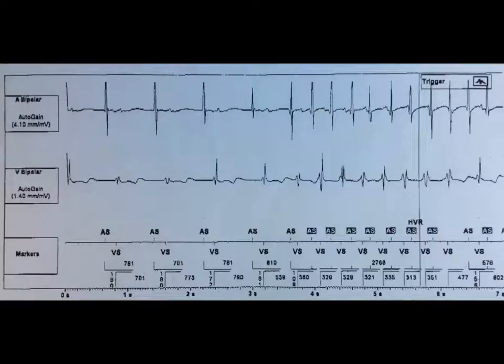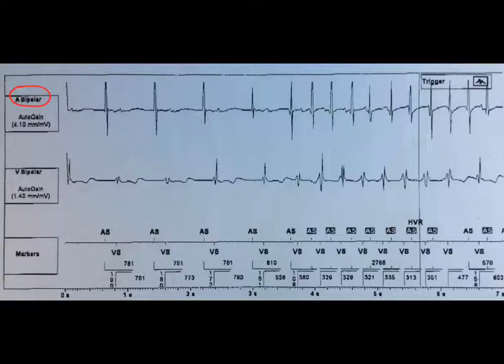The question is whether this is supraventricular tachycardia or ventricular tachycardia. The upper channel shows the atrial electrograms, and the lower channel shows the right ventricular electrograms.